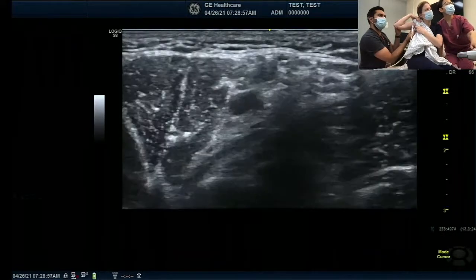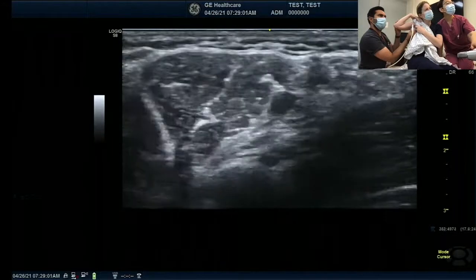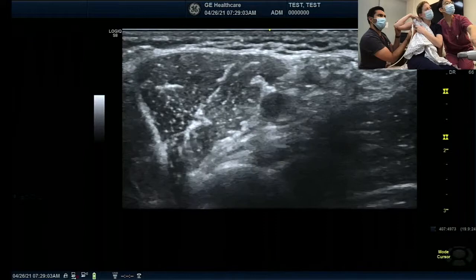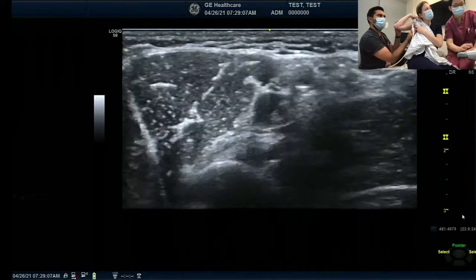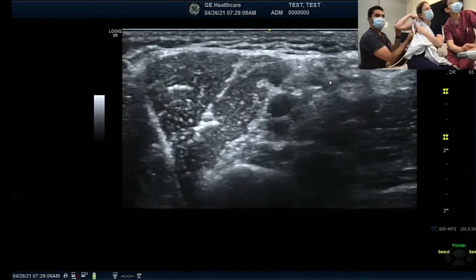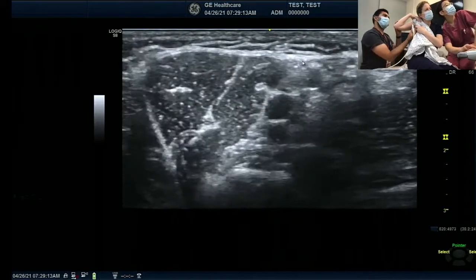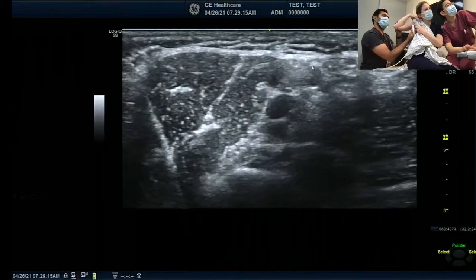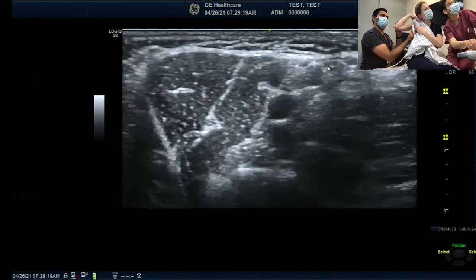So, axillary artery. Okay. Her case is... No, I see the median. I see the ulnar. I'm going to use the cursor. Radial. Your axillary artery is this one. And median nerve, yeah, that thing. Ulnar nerve, this one. But why can we not see well? That's interesting.